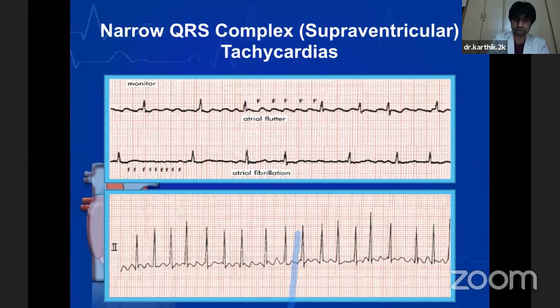And then the moment you know that step one, it is a tachycardia, it's a rhythm strip, irregular rhythm, and the patient has varying RR intervals, so it's an irregular rhythm with tachycardia. And then you start looking at the PQRS relationship. So we can see that there are quite prominent P waves, but there is discordant PQRS relationship.